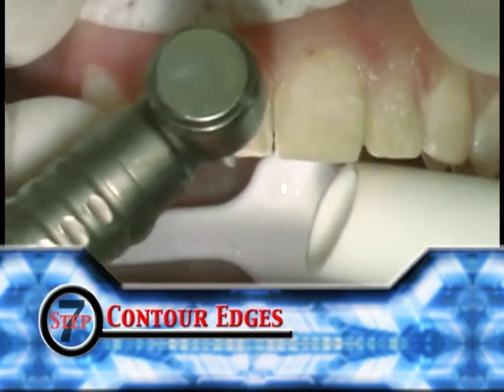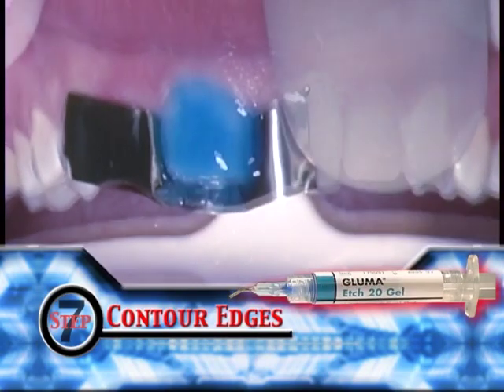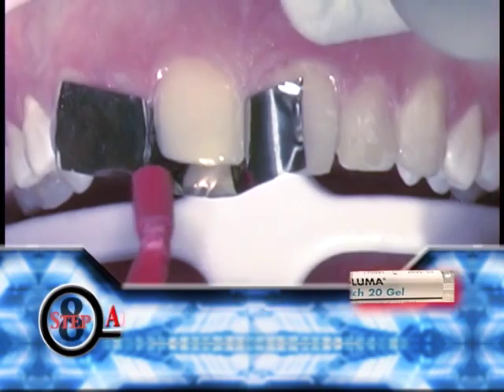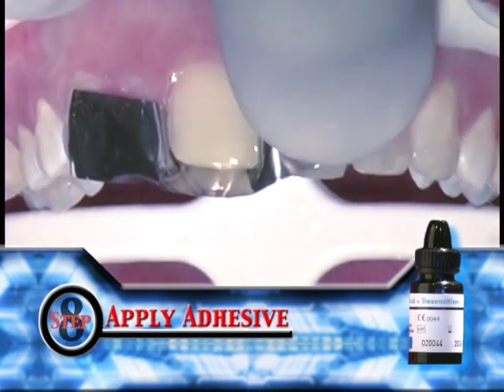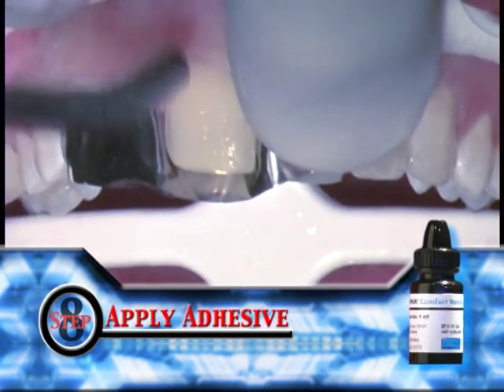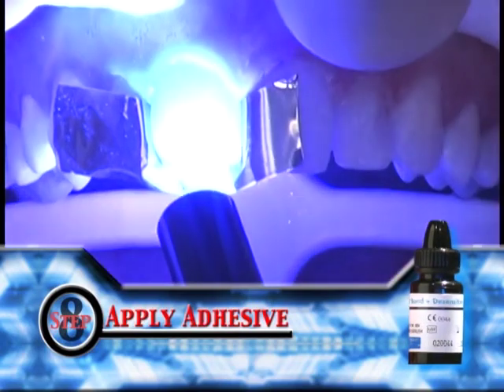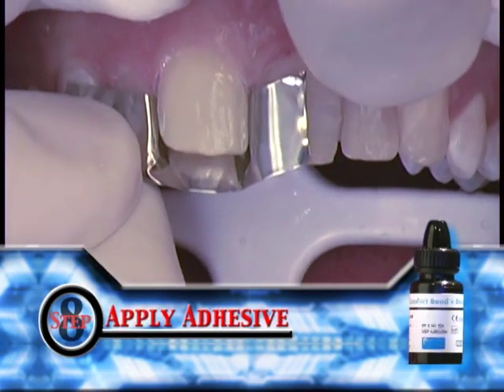After the cutback is finished, dead soft foil will be used to isolate the tooth being etched. This will prevent the bonding agent from sticking to adjacent teeth. Now apply 3 consecutive coats of Gluma Comfort Bond Plus Desensitizer adhesive. Wait for 20 seconds and allow the solvent to evaporate by air drying for at least 5 seconds, followed by light curing. After curing, remove the dead soft foil to prevent a space or gap from forming.